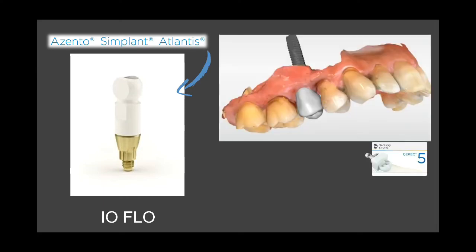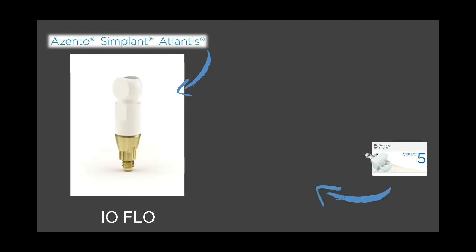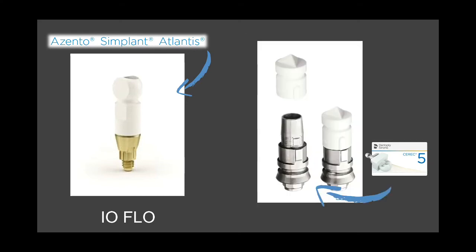Now, if you want to do everything in-house, if you want to restore your implant with a tie base, you don't want to send anything out for a custom abutment or send anything to the laboratory, then you're going to want to use something that looks like this. This is a Sirona scan post. Now you can see that we have two components here. We have a scan post and we have a scan body. This scan body simply slides over top of the scan post and gives your CEREC software all of the information it needs to design the perfect implant crown.